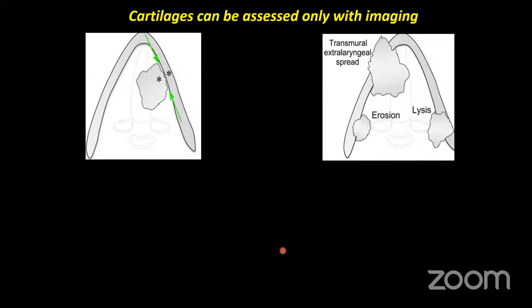So just to highlight what is cartilage imaging and which is the better one, is it the CT or the MRI?